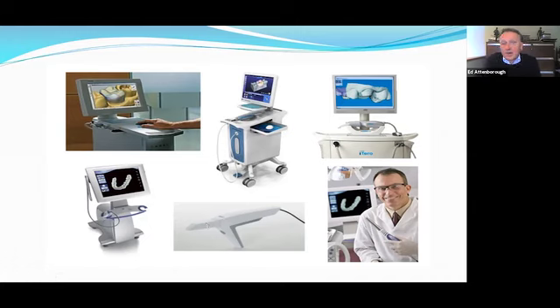So typically all intraoral scanners can only capture 2 or 3 teeth in one view or image, and when they quote accuracy, quite often that is accuracy on individual scans as opposed to the entire arch. So you will always find with intraoral scanners that on single tooth or prep scans, they're more accurate than across the whole arch. Because the way they work is that they capture a single image, and as you move around the arch with the scanner, the software stitches the images together. So it basically stitches a whole set of images.